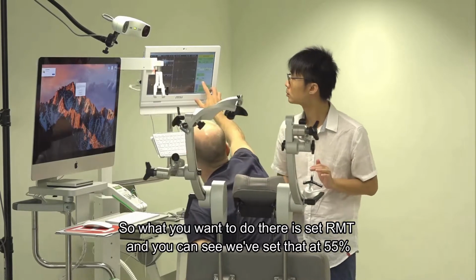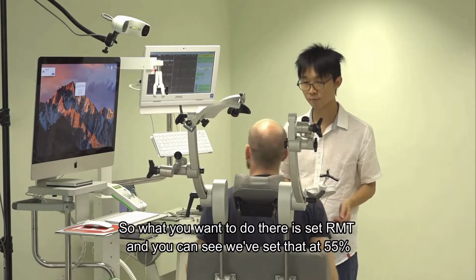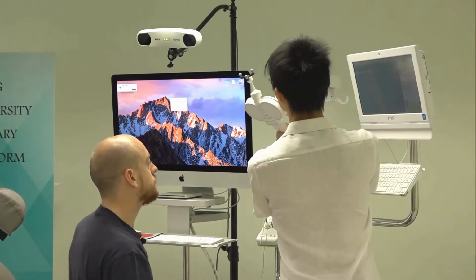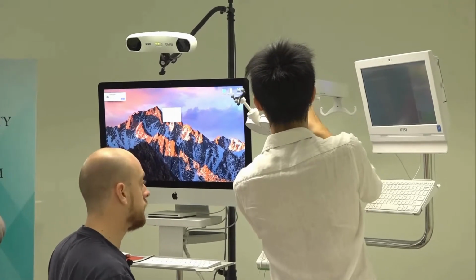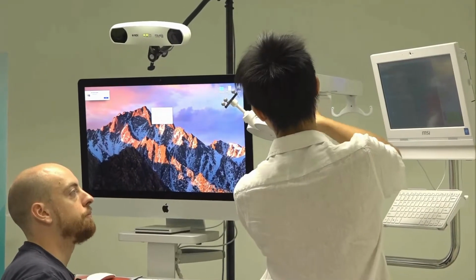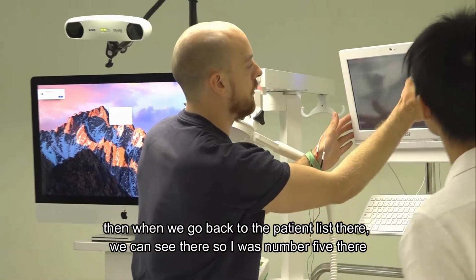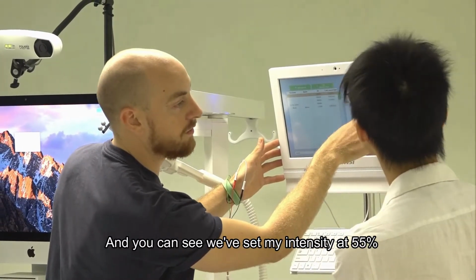So what you want to do there is set RMT, and you can see we've set that at 55%. Do you understand that a bit clearer? Cool, okay. So next thing, you can then secure the coil back in there. Excellent, cool. And then when we go back to the patient list there, I was number 5, and you can see we've set my intensity at 55%.